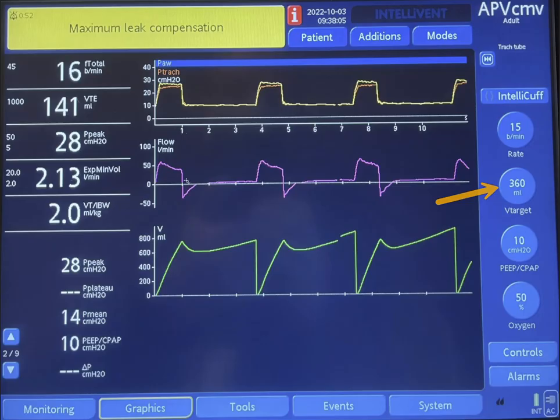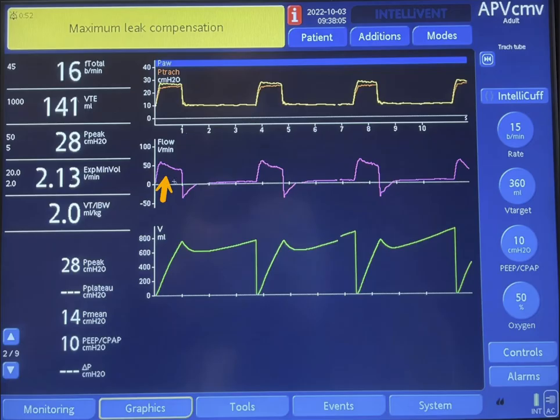The reason for that is because there is a huge leak and the machine is trying to compensate for it. Take a look at the area under the curve on the flow-over-time curve. The area in inspiration is much larger than the area under the curve in expiration. This indicates that part of the air that is inhaled is leaking.